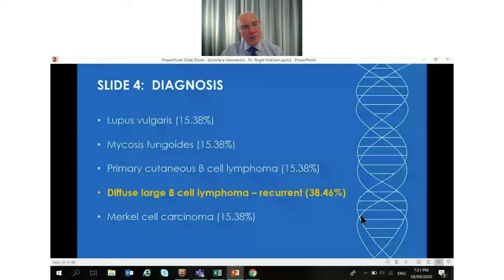And in fact, I didn't give you all the information, I'll make it too easy for you, but the patient had several of these nodules growing quite rapidly. I think one of the lessons here is in thinking about these biopsies, when you see something that's very deeply seated and nowhere near the interface, well, it takes you away from a T-cell lymphoma most of the time, not always. But then you start thinking about systemic disease. And just as we had in the second case, when there's an awful lot going on, you need to get some more information about the patient to see what's going on in the background and see whether this is a cutaneous manifestation of systemic disease.